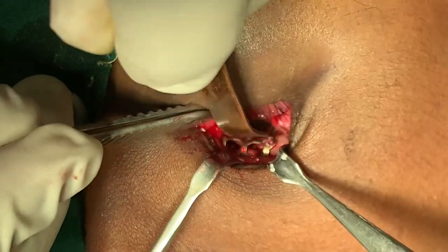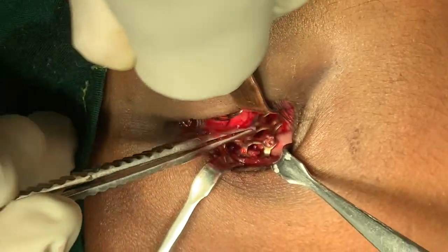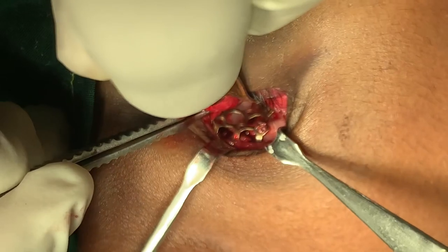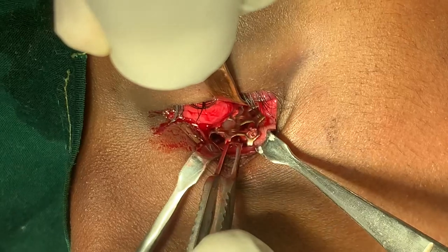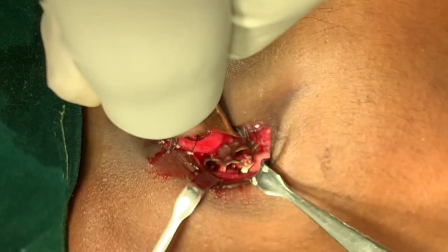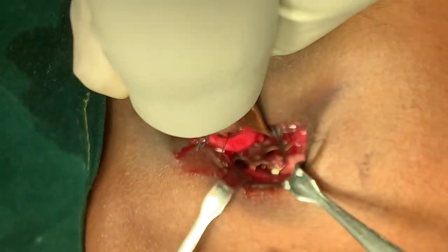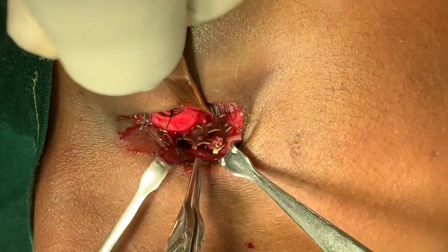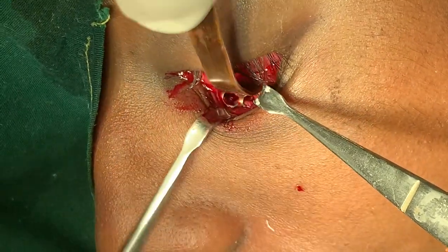There's going to be no scar. It's a very nice approach. Needs some amount of expertise and experience to do it. But you see, all the way down, we reconstructed the orbital floor. Even if the defect is just a centimeter, but you see, it's quite long. It's about 3.5 to 4 centimeters long. That can cause herniation of the orbital content, especially the fat, into the sinus, which is just beneath this. That's a hollow cavity, so that will easily take in fat from the orbit, and once it happens, it reduces the volume of the orbital cavity, and thus results in the condition of enophthalmos or a small eye.